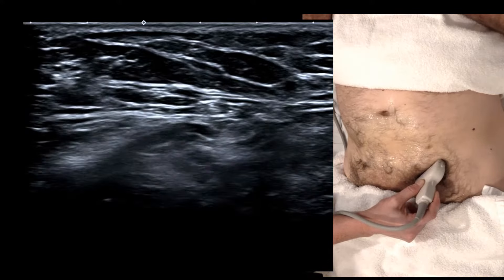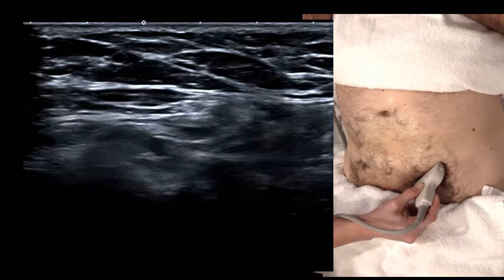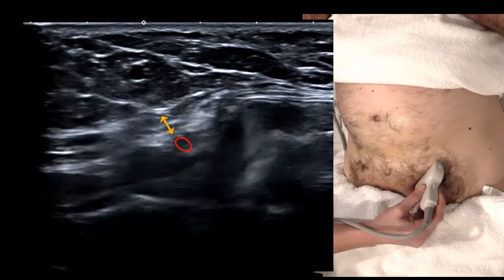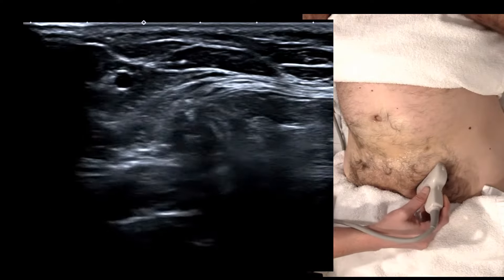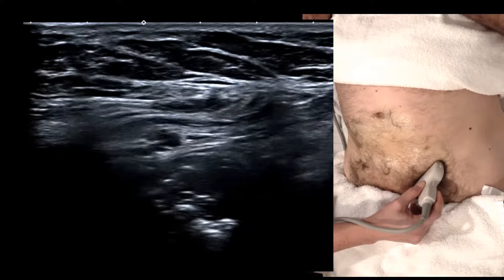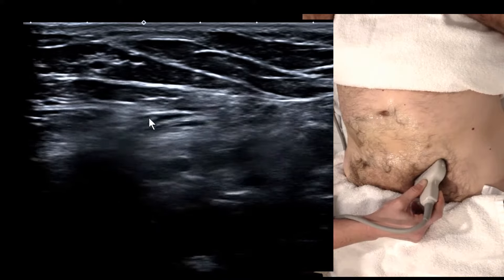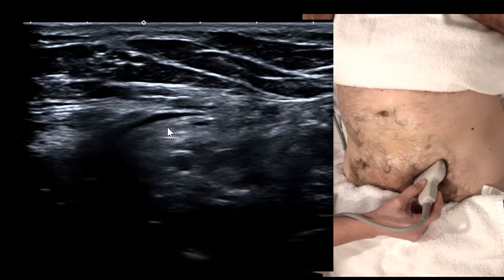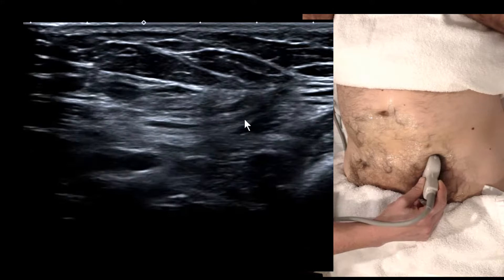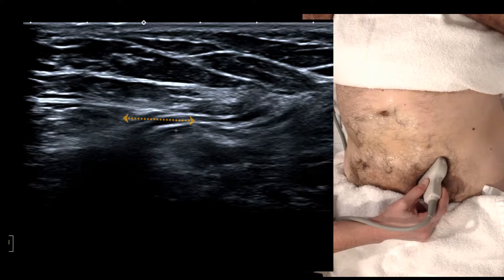We're only really interested in the measurement on strain — just watch it with a gentle push. The actual deep ring is not where that hernia was coming from; it stayed put and nothing was sliding through. So you know it's not an indirect hernia.